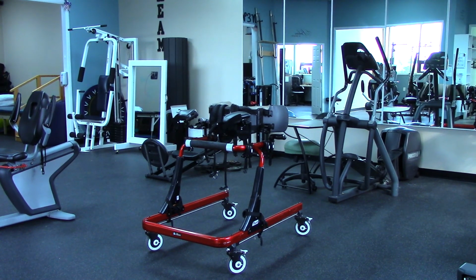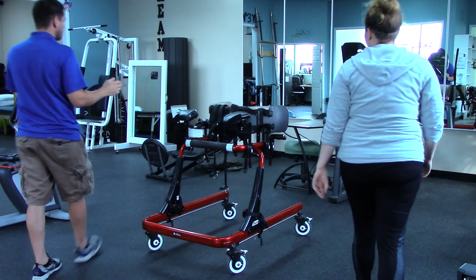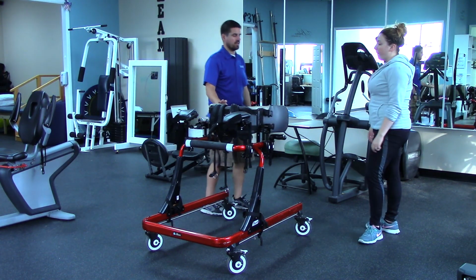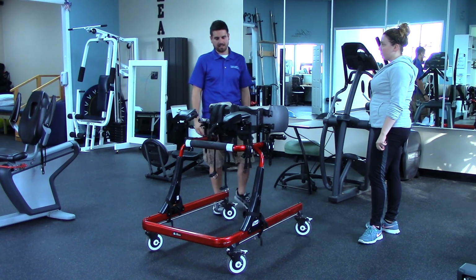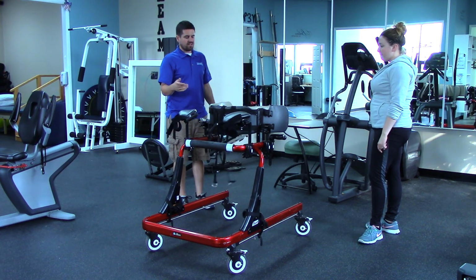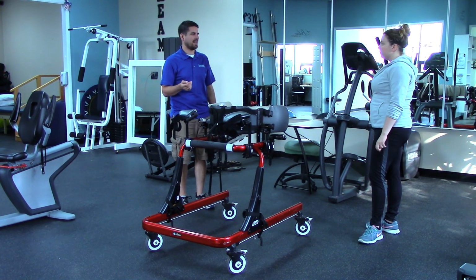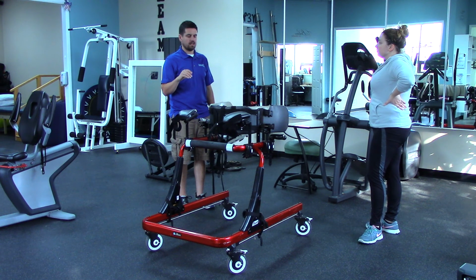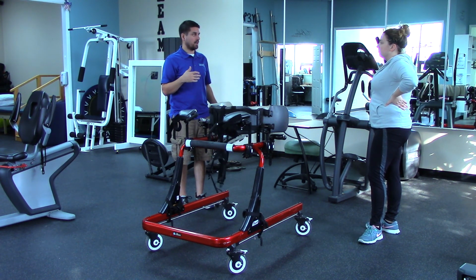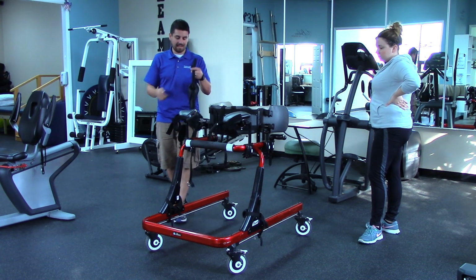All right, the Rifton Pacer. So the person can be completely dependent in here, like my main man that I got in today. But generally speaking, you want them to be, maybe they can stand, but have difficulty walking. Maybe even standing might be difficult, but they can assist in standing. That would more likely be the ideal patient.